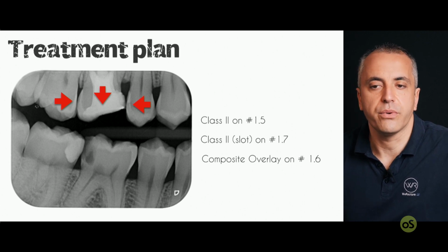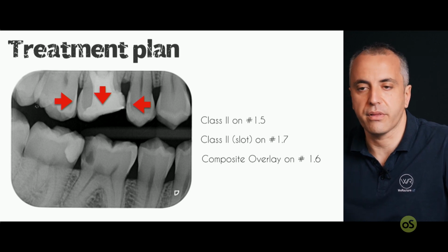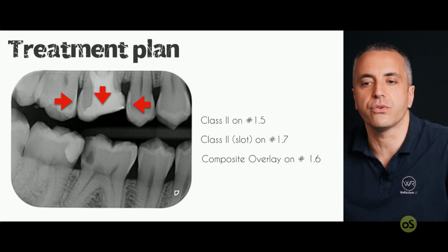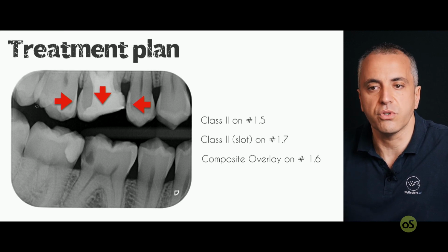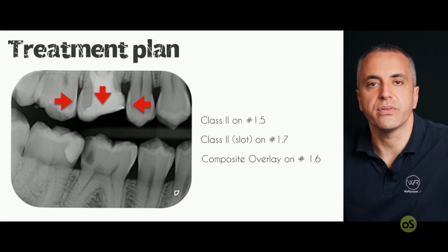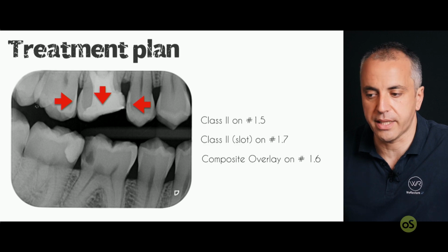We chose the composite for several reasons: for the thickness of the restoration, and also for the relationship with the antagonist, which was not in ceramic. We also chose it because it's a wonderful material and you can repair it when it breaks.